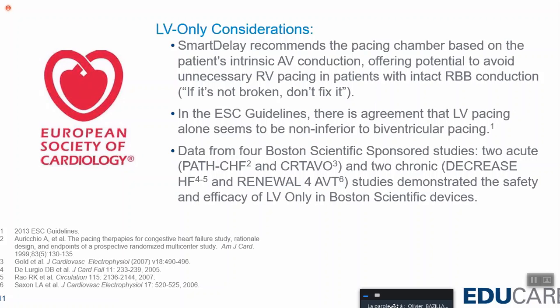As Dr. Eshaidi mentioned, you will save a lot of energy. You will resynchronize properly the patient, even with LV only pacing. Even if, of course, then some concerns. According to the ESC guidelines, clearly we have a clear agreement that LV pacing alone seems to be non-inferior to BIV pacing. So clinically speaking, we know that it's safe. We have clinical data demonstrating the safety of LV only.